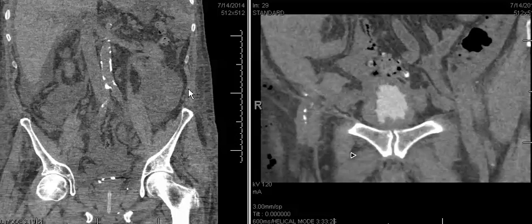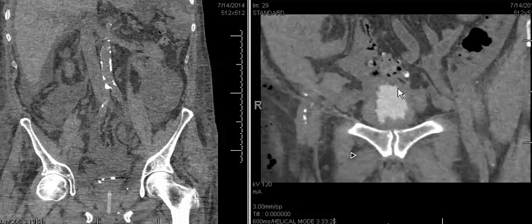In this 79-year-old male who experienced trauma, we have coronal images through the abdomen and pelvis. The imaging on your left side is CT of the abdomen and pelvis without intravenous contrast, and on the right side you have CT imaging through the pelvis after installation of cystographic contrast through the patient's Foley catheter into the bladder.